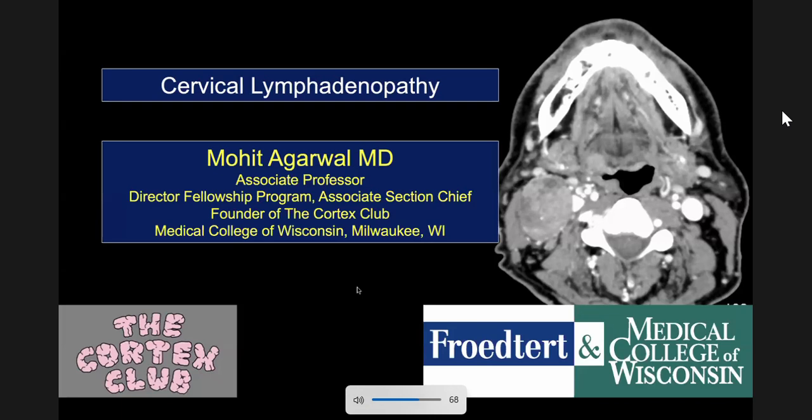None of us are strangers to cervical adenopathy as head and neck radiologists, general radiologists. What I'm going to talk about today is not anything different, but just an overview, a review of what are the different causes of cervical lymphadenopathy, what are the different features and when to call adenopathy, and talk about adenopathy in terms of individual cancers.